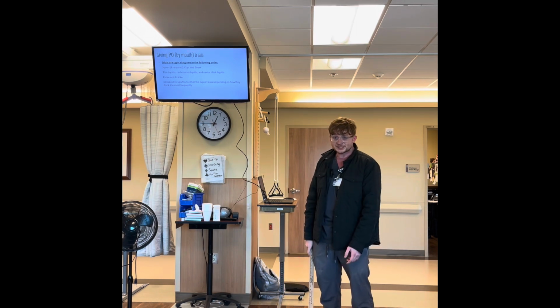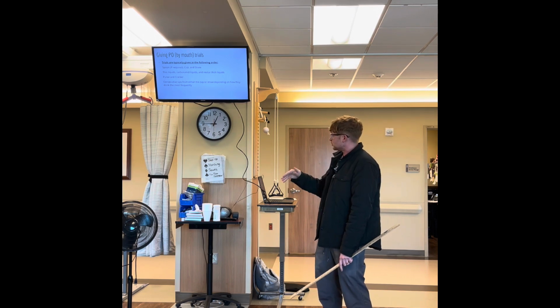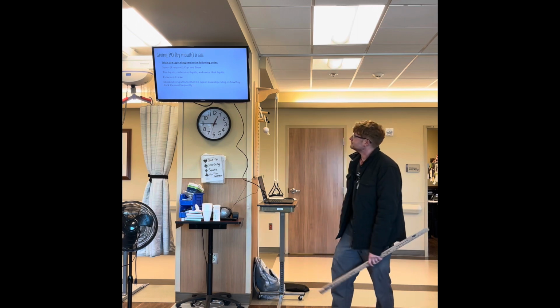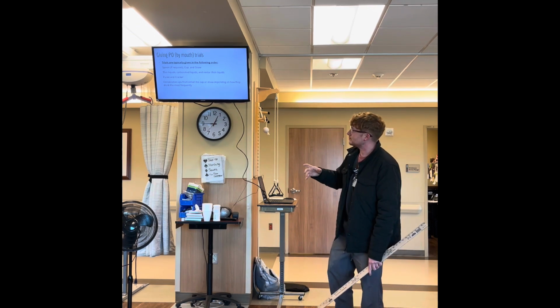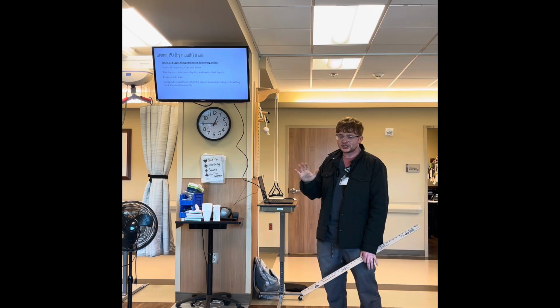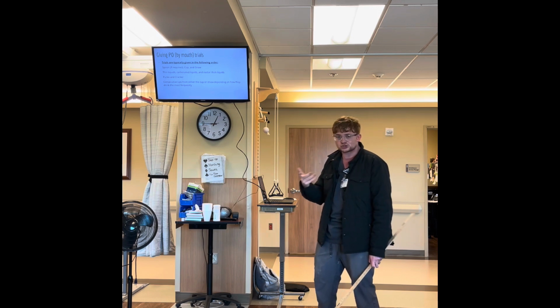That also is for bedsides too. We usually will go spoon, cup, straw for that as we're doing a bedside swallow test. And then we go to the puree and the cracker. At the end of the test, because usually they're doing one sip at a time, each drink, I usually ask them which one they drink from most, a straw or a cup.